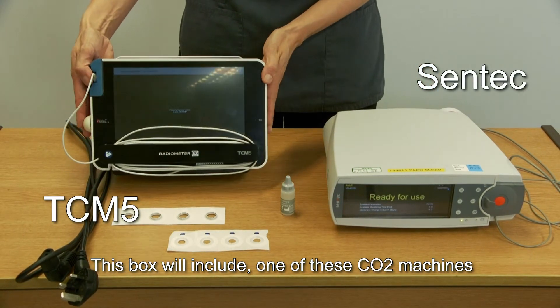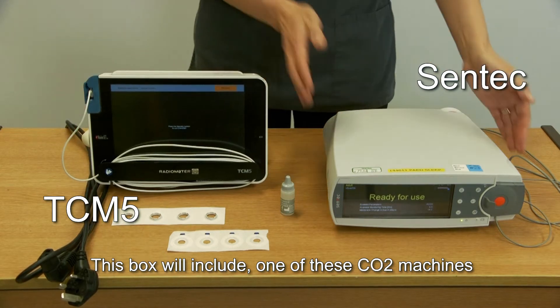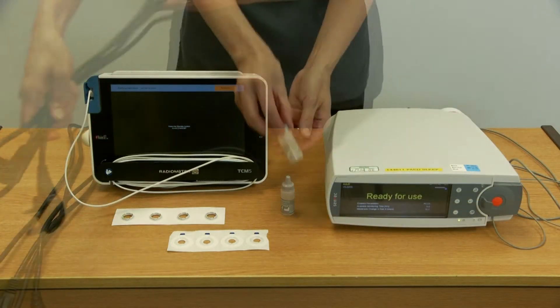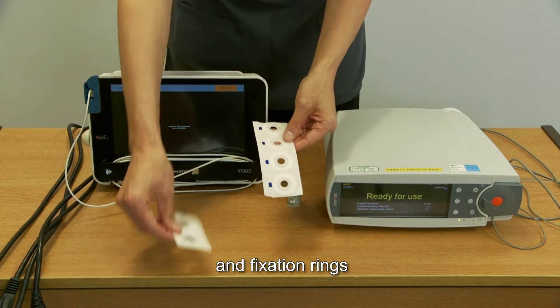This box will include one of these CO2 machines, a power lead, contact gel and fixation rings.